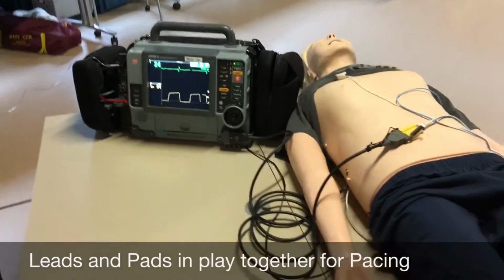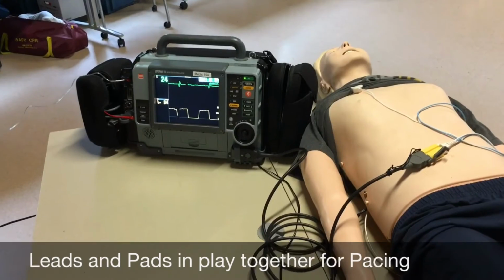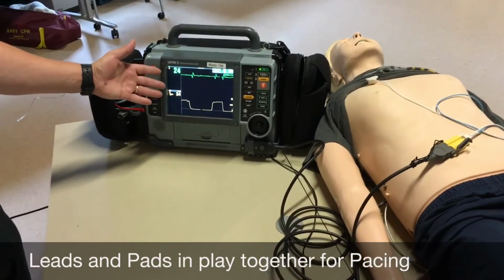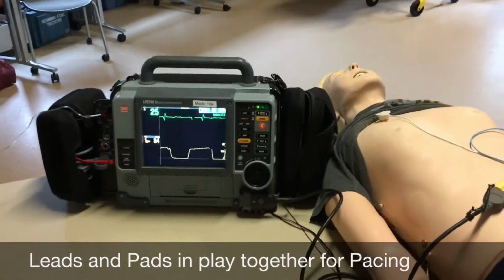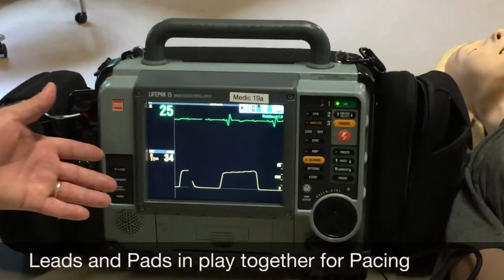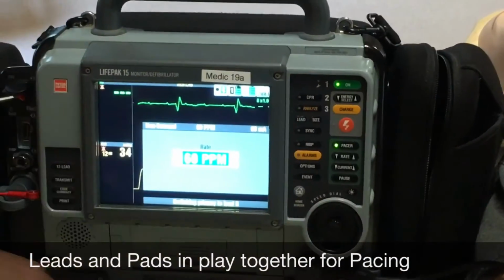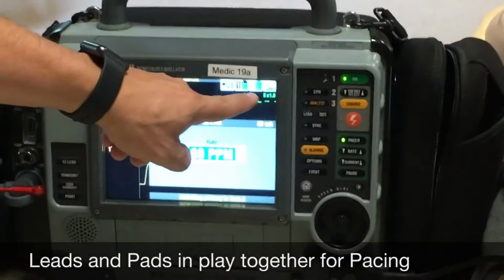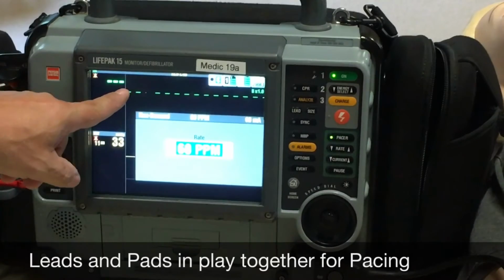Next, we're going to talk about when you have cardiac arrest and you get return of spontaneous circulation and you end up with a pulse but a rhythm that looks like this, third degree heart block. And the first thing that people will do is say, well, let's pace that. And they have the pads on because they have cardiac arrest going on. And so they turn on the pacer, and you'll notice that the machine automatically moves to lead 2 to do its sensing, and we lose the EKG.